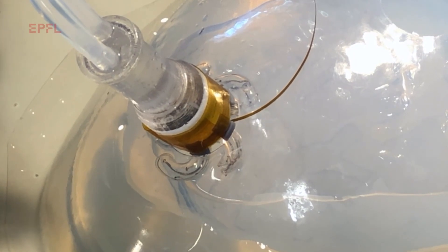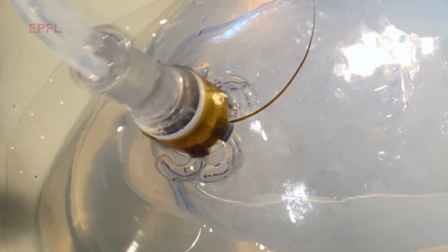We have developed a soft electrode array that can be deployed below the skull at the surface of the brain. This is useful to enable measurement of neuronal activity in the context, for example, of epilepsy.